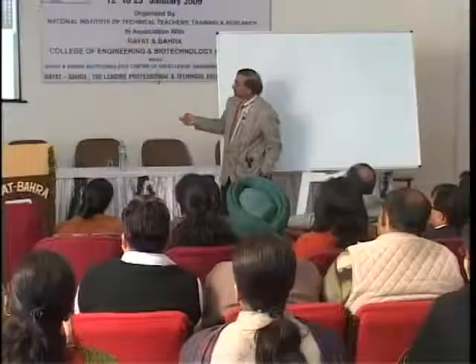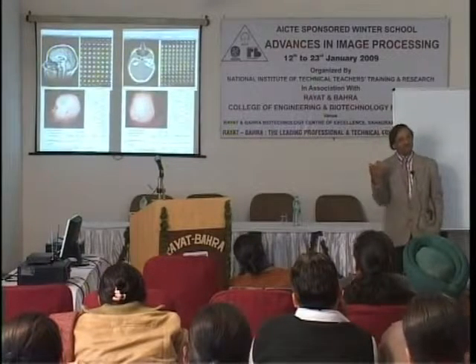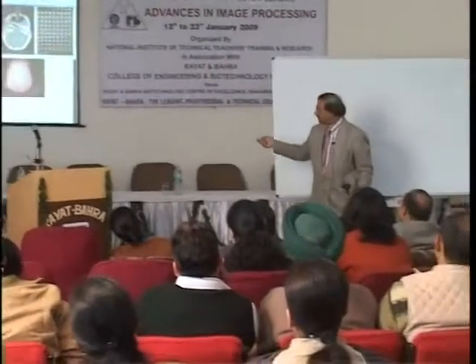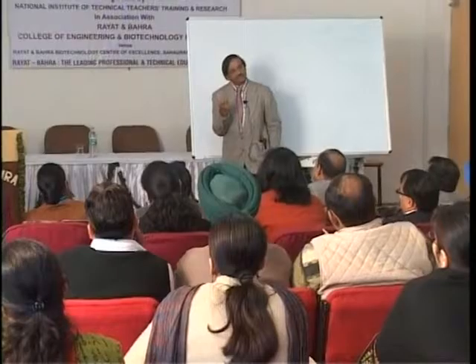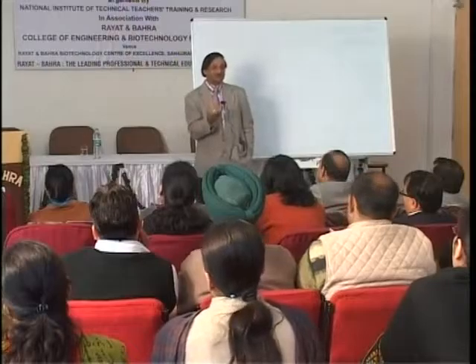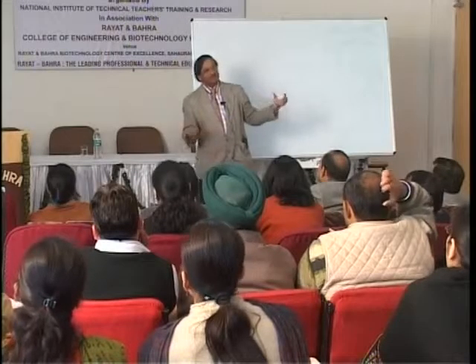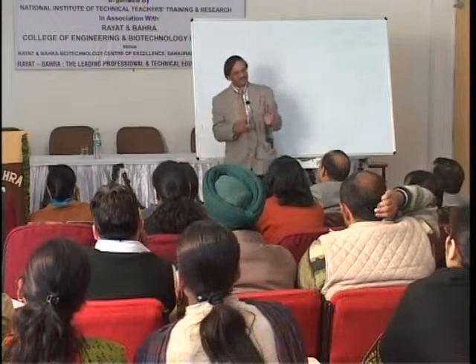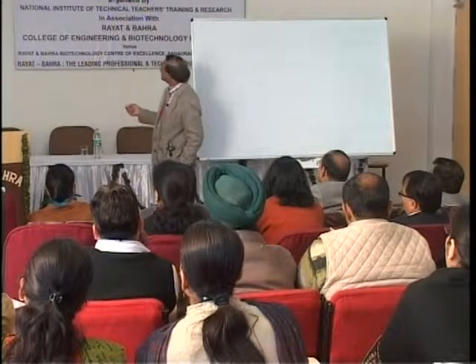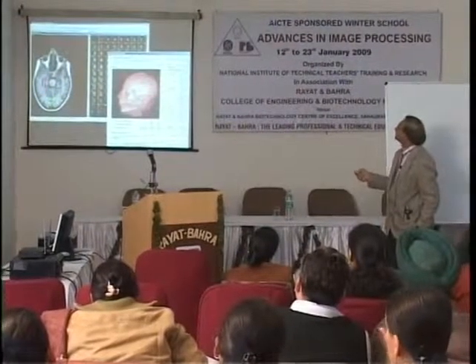This, of course, you can derive from a common data set, an image data set where you have only, say, SAG images or sagittal sections of the brain, and from there you can reconstruct a 3D facial reconstruction. This is an actual 3D reconstruction from a broken face, say in a blast or something. You can reconstruct that image, add soft tissue, and then have a derived 3D image of the face. Next. Exactly, you can have the face. Yeah, next.